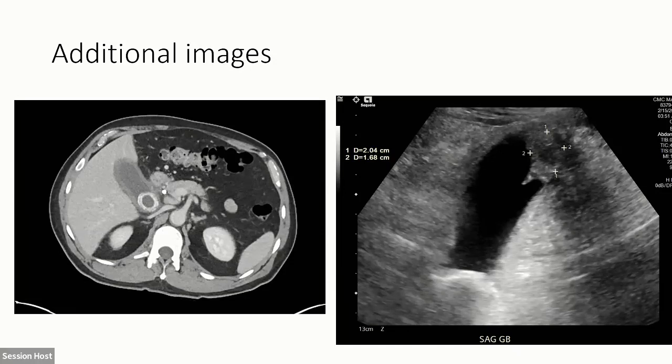But then they got an ultrasound as well. And the ultrasound is what had everybody all concerned. So on this ultrasound, they were reading that there was a mass in the infundibulum of the gallbladder, something like that. So no mass on CT scan, no mass on MRI, but a mass on the ultrasound. So the general surgery service calls me all in a worry. They're just in a panic that there's a mass.